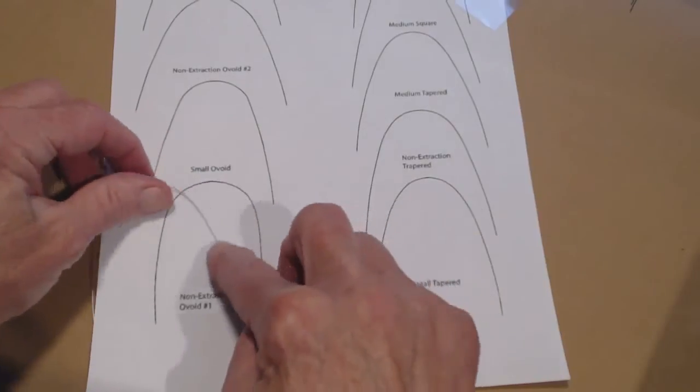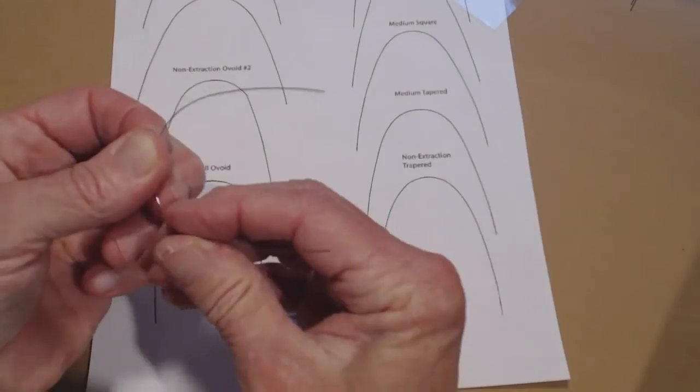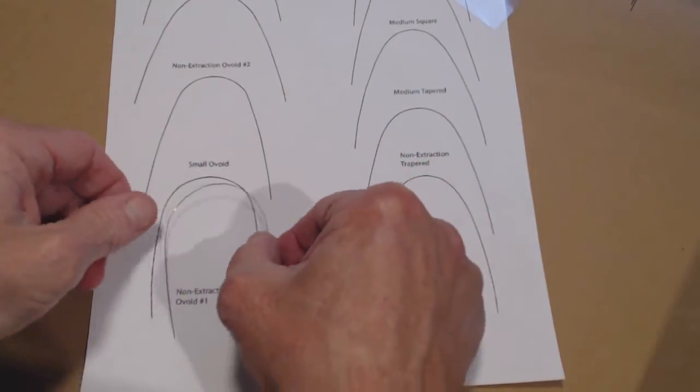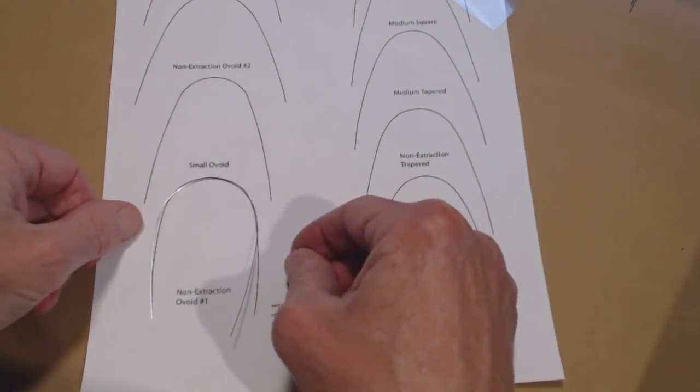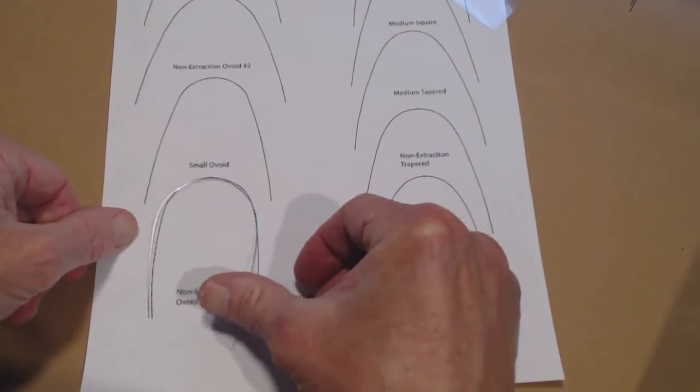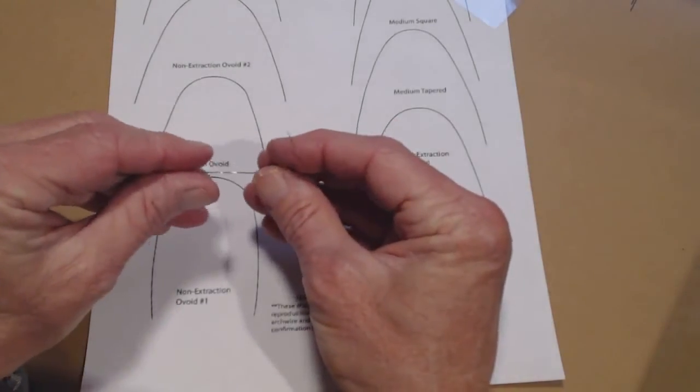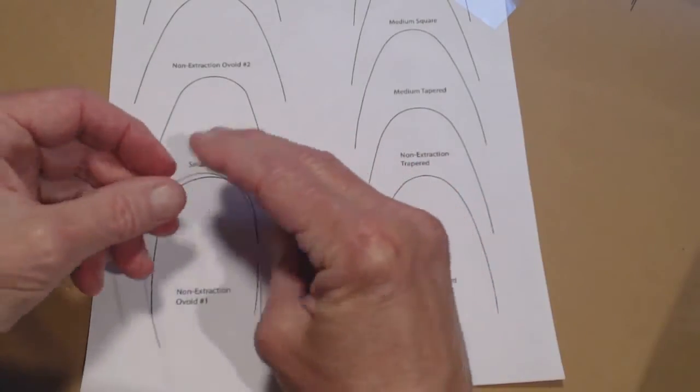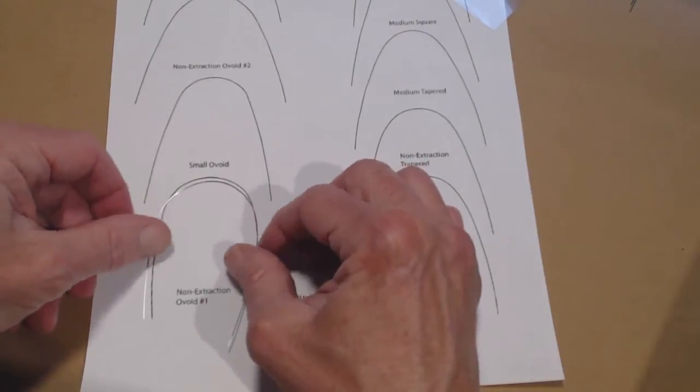Now I have to make that get tighter toward the back. Using my thumb and forefinger, I can make it get tighter toward the back. Can you see how it's got a little bit of potato chip in here? That's what I call it when the wire's not straight. That's a super easy fix. You just take the twist out like that and then lay it back flat on the tabletop.